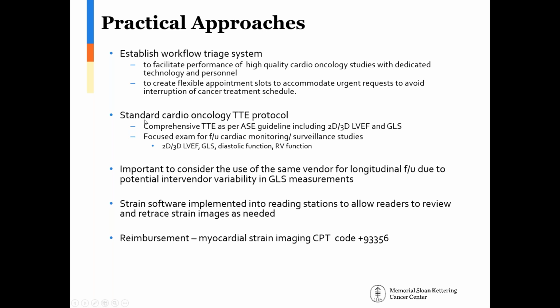It's important to establish a standard cardio-oncology TTE protocol, which typically includes a comprehensive TTE as per the ASE guideline or as per the EACVI guideline, which should include 2D and 3D LVEF if possible, and global longitudinal strain. Follow-up focused exams for cardiac monitoring and surveillance studies can be performed, especially in light of COVID. That includes just the 2D, 3D EF, GLS, diastolic function, and RV function.